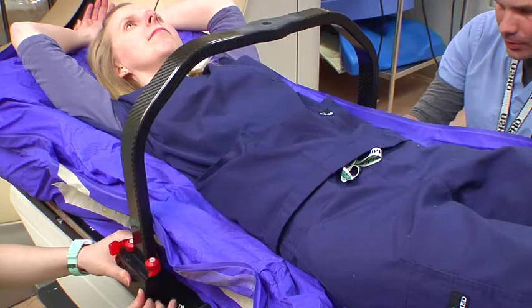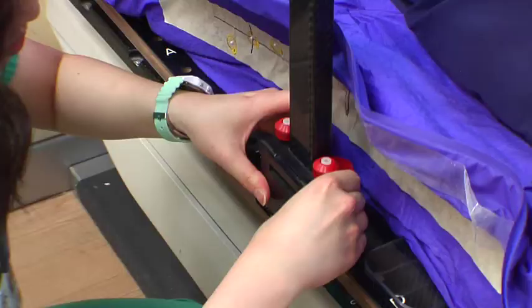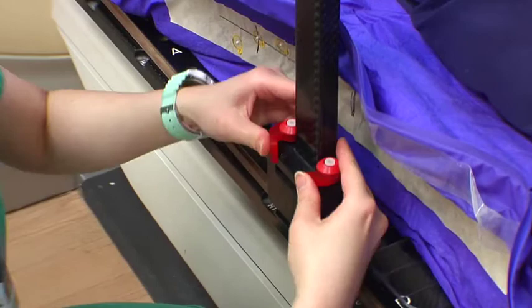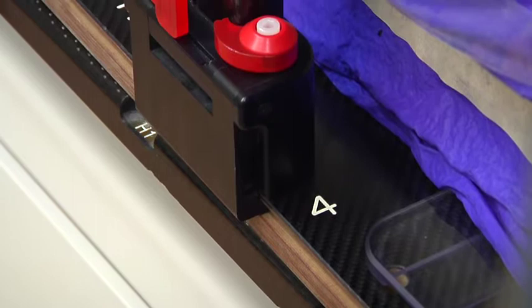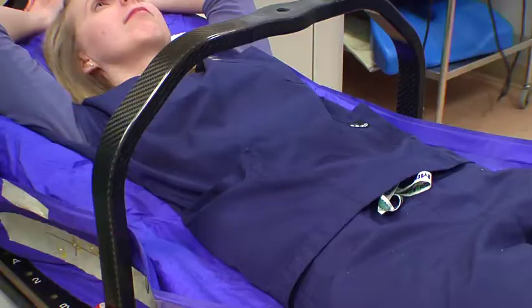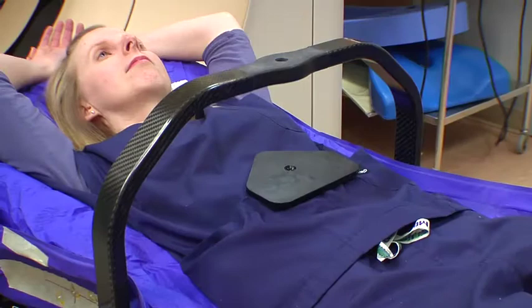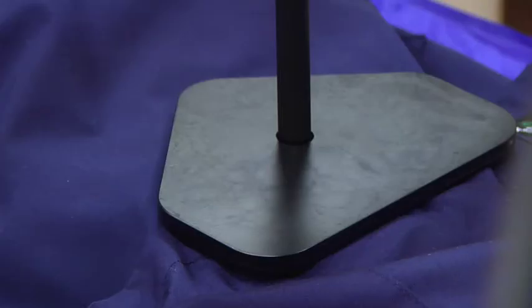I'm going to put it on 4. We're pretending like this isn't her ribcage that we're pressing down on. This one's not long enough. Please fly forward for me. So then I screw it down — let me know when you're ready. I screw it down until I get to a point that is good for the patient and for us for compression. Right now it's at 150. It depends on the patients and according to how much time they have had children.